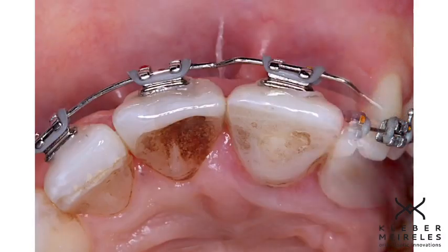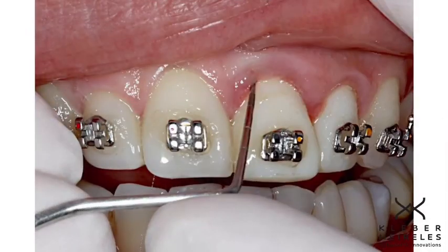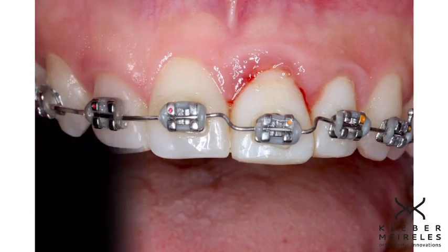Slow extrusion is one type — this is the fast extrusive protocol. And here again, I'm controlling the movement by doing two bends: step down and step forward.